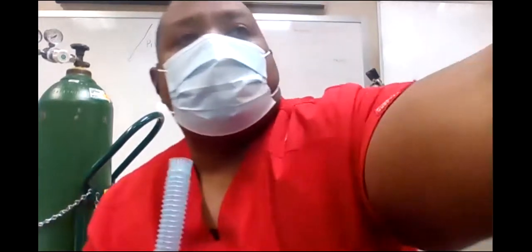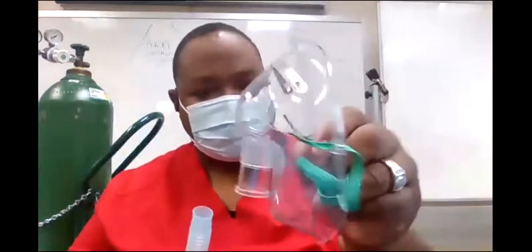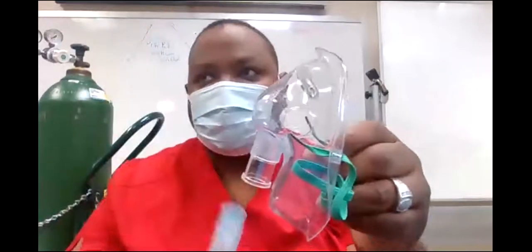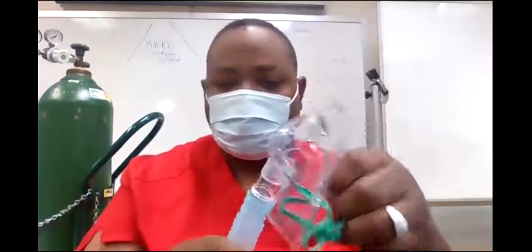And then I brought my stuff in. Give me that bag, that mask that's in that bag right there. All right, an aerosol mask, a regular little aerosol mask. It's the same kind of mask you see on breathing treatments. This is what's called an aerosol mask. It's got big holes on the side. You can either put your breathing treatment right there or one of these systems. The aerosol mask is multi-use.